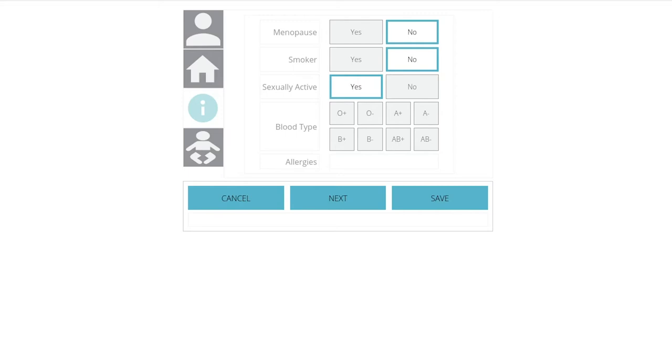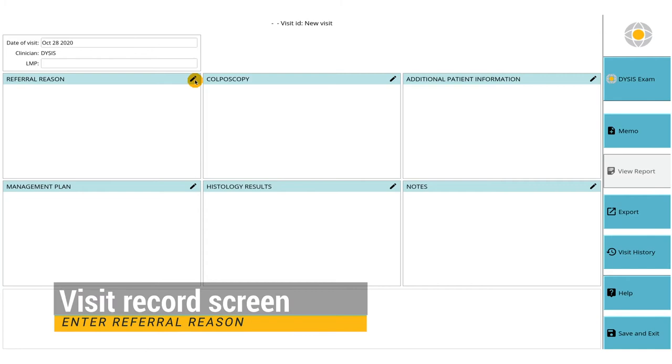From the patient visit record, press the referral reason box and enter the referral information by selecting the pap smear, HPV results and types, or the reason for colposcopy.